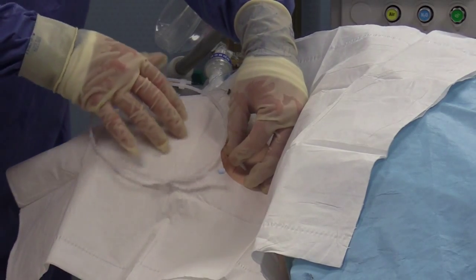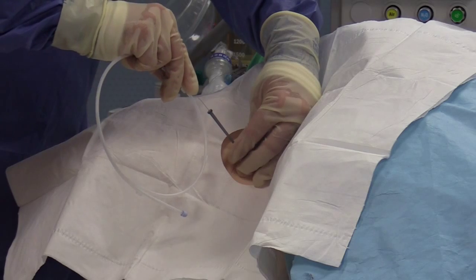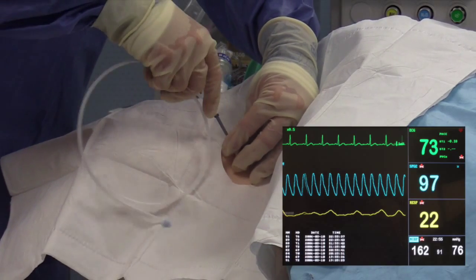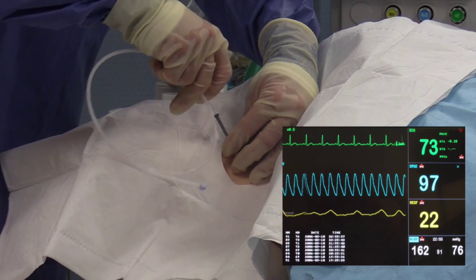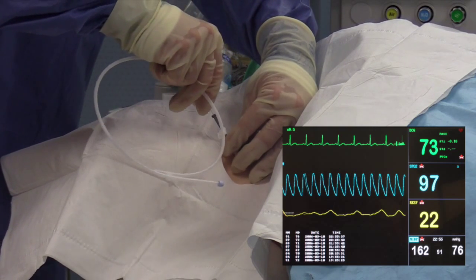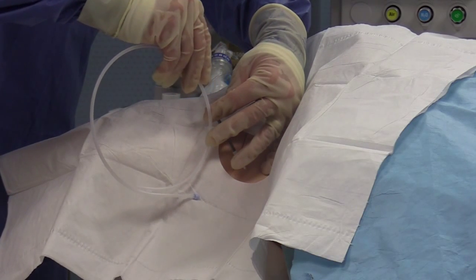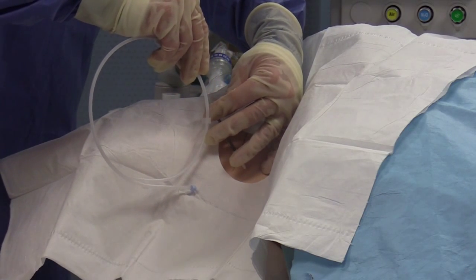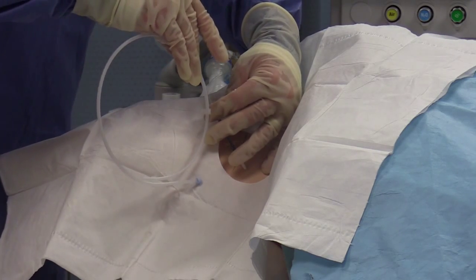Retrieve the guide wire and insert the guide wire through the cannula without forcing until resistance is felt. While inserting the guide wire, continue to glance at the monitor to ensure that the guide wire is not causing any ectopy on the EKG. If ectopy is noted, pull the guide wire out slowly until it is resolved.